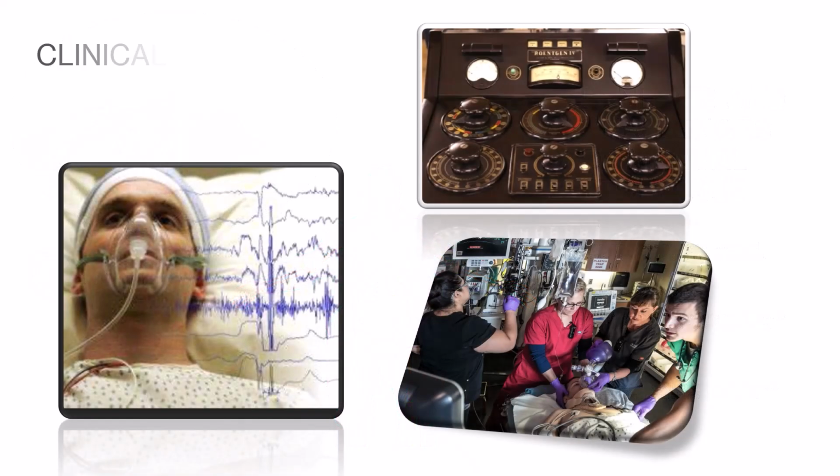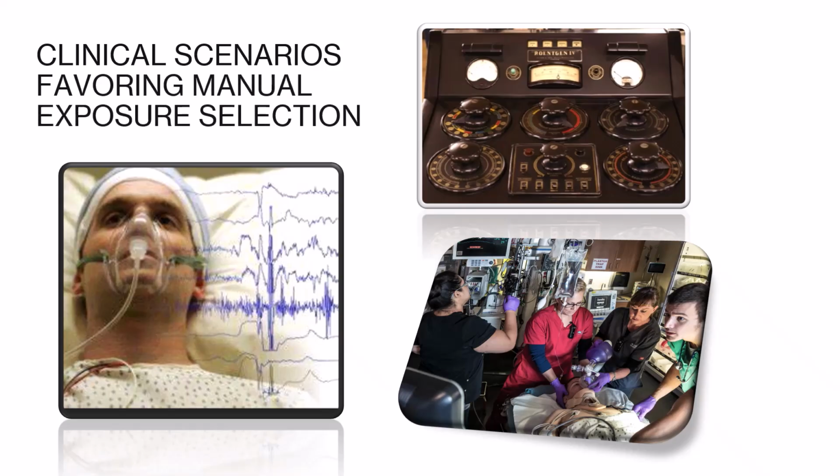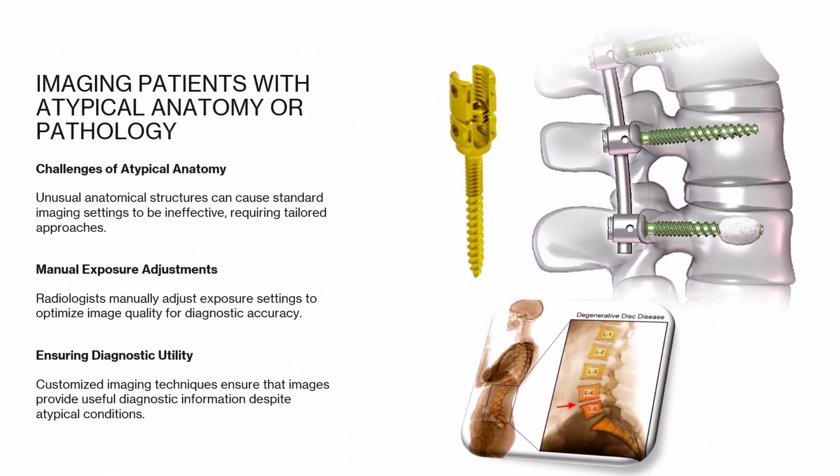Certain patient and equipment conditions necessitate manual exposure selection. This section highlights typical clinical scenarios where manual techniques are preferred over automated methods. Patients with unusual anatomy or pathological conditions may not fit preset parameters, requiring manual exposure adjustment to obtain diagnostically useful images.